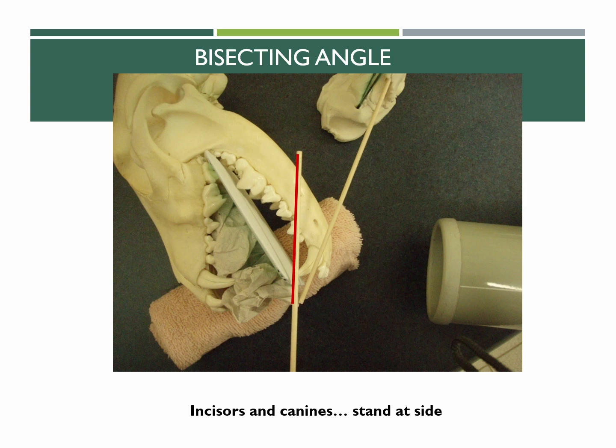Incisors and canines, so teeth at the front of the mouth, you're going to look at the side of the skull. You're going to stand at the side to get that angle. Right? So in this case, we have a mandibular canine. And you can see there's the film laying flat, and there's the canine tooth.